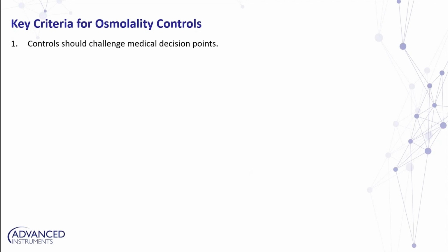First, controls should challenge medical decision points. Freezing point osmometers make measurements over an extremely broad range, so testing controls at medical decision points ensures the accuracy in the clinically relevant range.